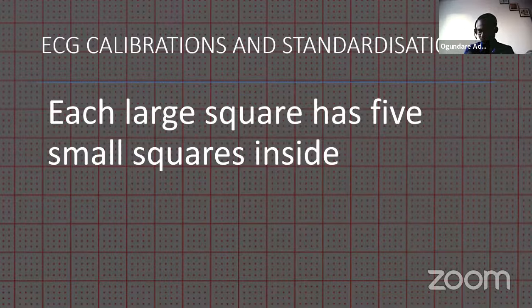The boxes are square, so equidistant. I hope we understand that. They have 5 smaller boxes inside. I mentioned to us earlier that a large box is 5 millimeter, and I just said to us again that a large box has 5 smaller squares inside.